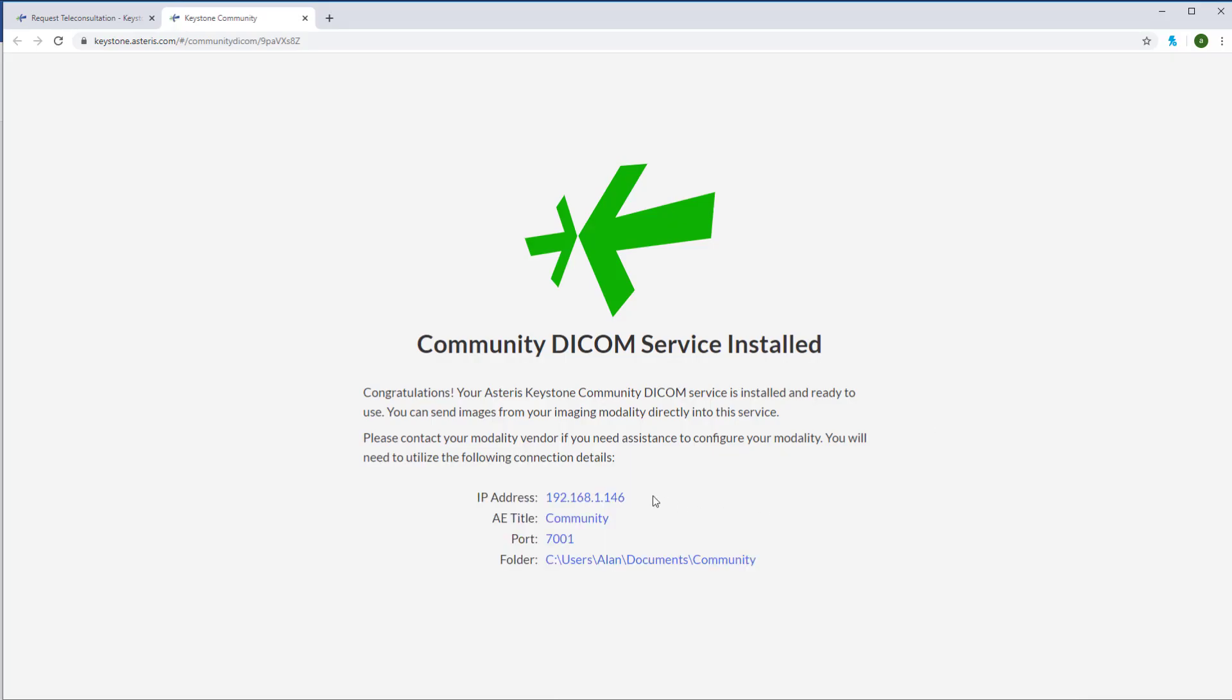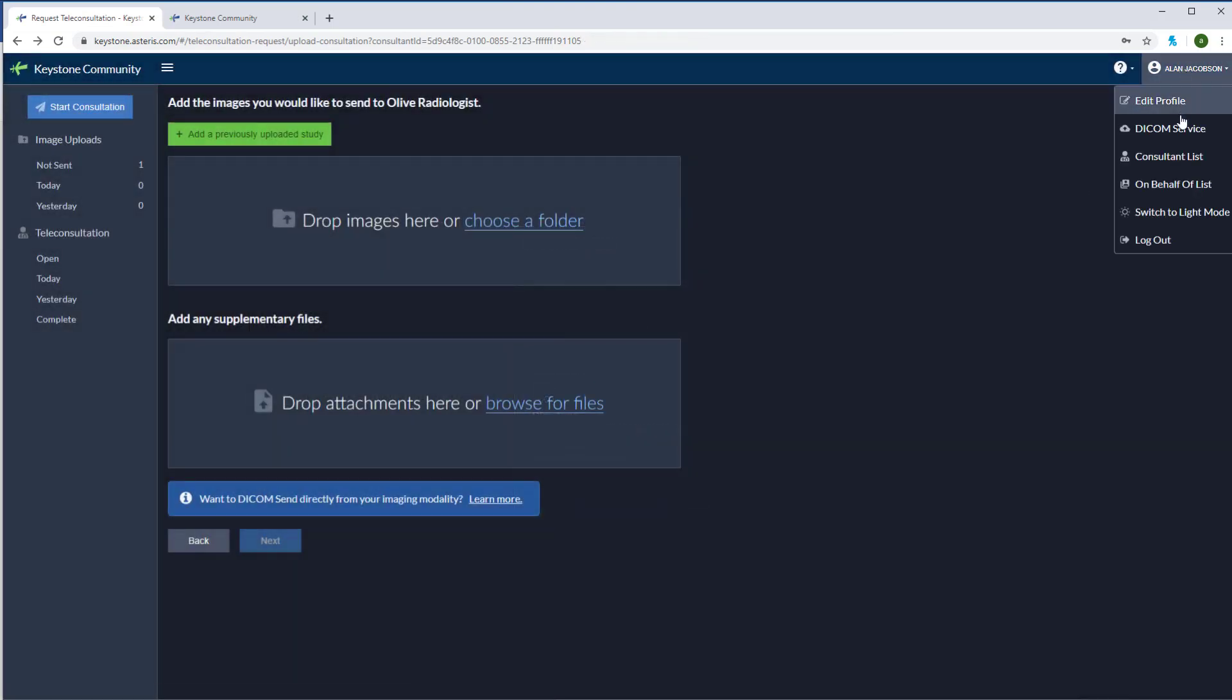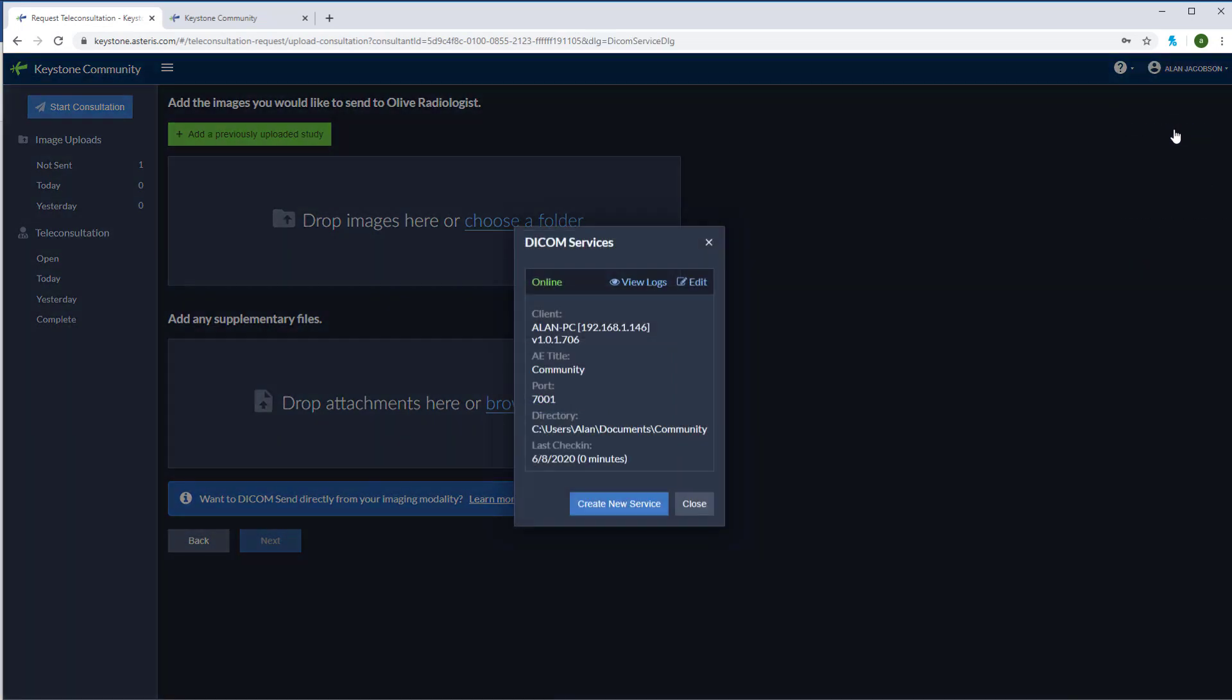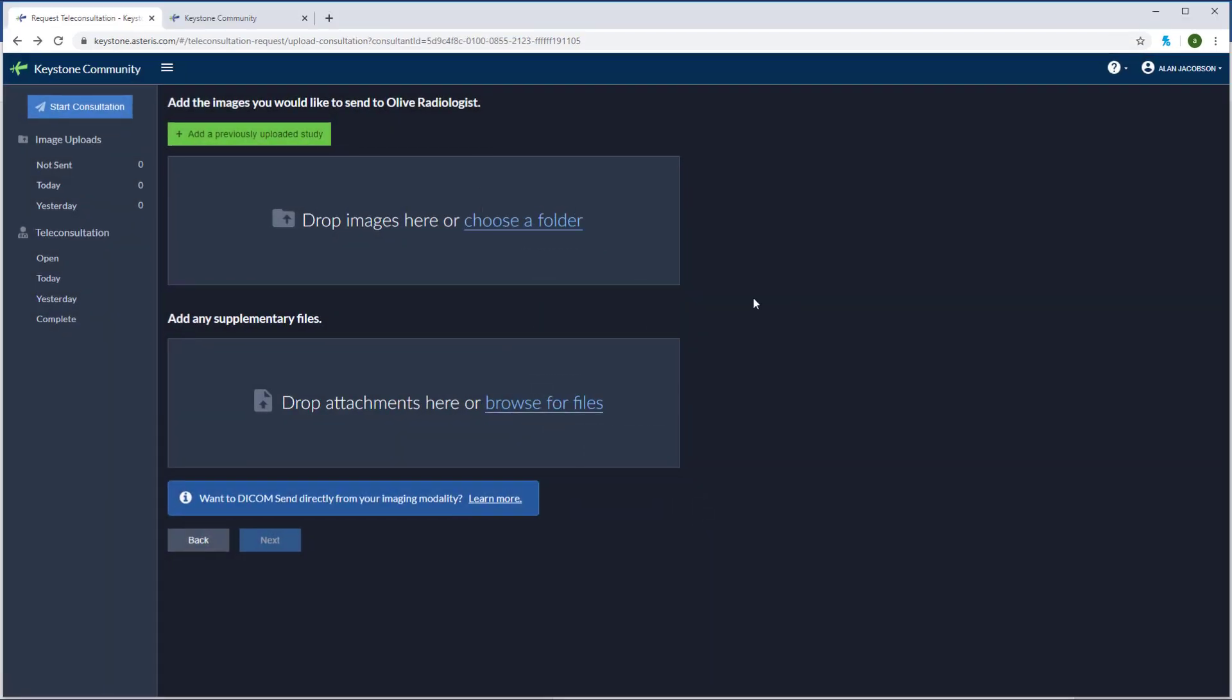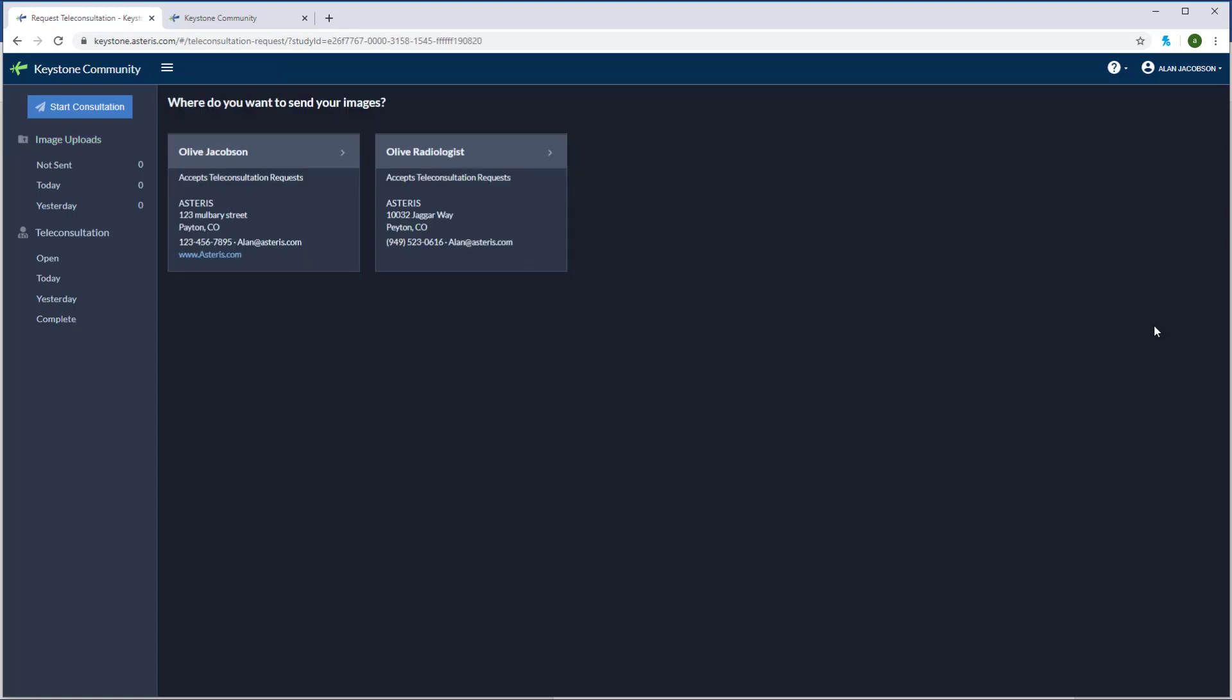You can see now you have a unique IP address, AE title, and port number to add to your modality. I can also check the status of my DICOM service at the top right by clicking DICOM service. And I can see my service is online and we've got our AE title, port number, and IP address here. Once you send a study from your modality to Keystone Community, you'll see it show up under the image uploads tab. You can see here that I've sent several studies from different modalities to my Keystone Community account. To send a study from the list, click send and choose the desired radiology service.